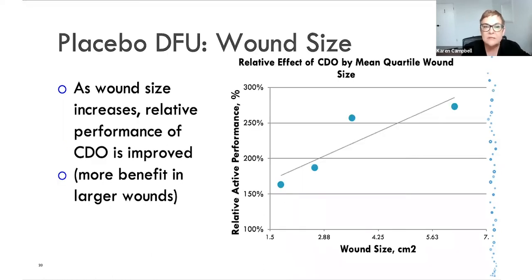What was really interesting, as the wound size increased, relative performance of CDO improved as well. And so there was more benefit for larger wounds. And you can see here the relative performance does increase almost up to 300%, but not quite.